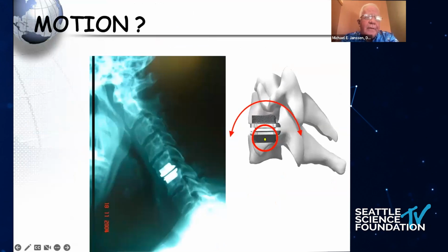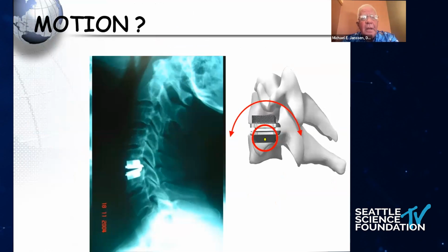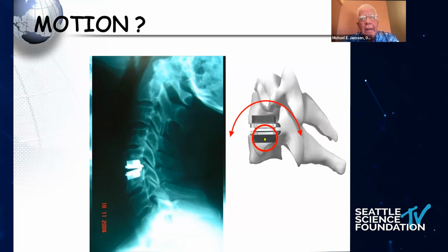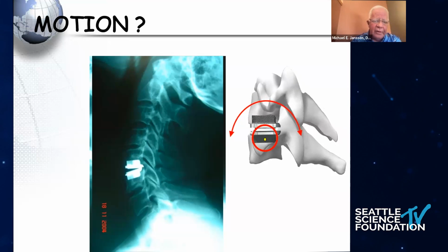Well, I think it's obviously a lot easier to see the technology move in the cervical spine than in the lumbar spine. And the big question always is should you have something that's more mobile, something that unloads the facet joints? And then the key here, though, is it's not as forgiving as the fusion. You have to do the best you can to reproduce the axis of rotation so that you can get the motion that you're trying to achieve out of all of these types of technologies, no matter what they are.